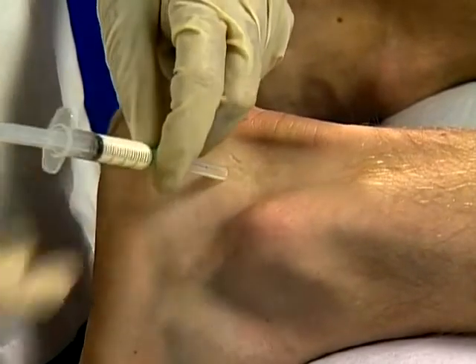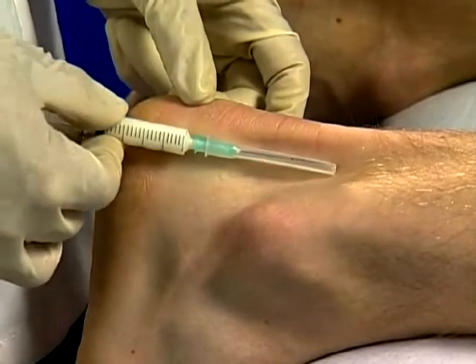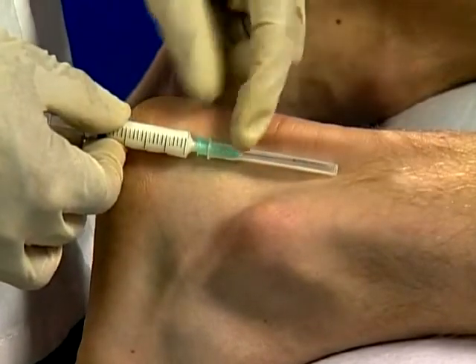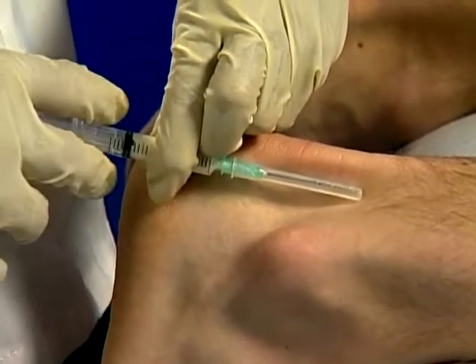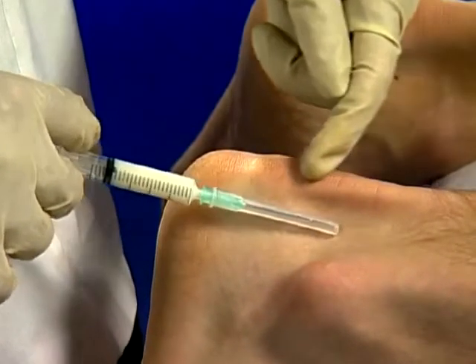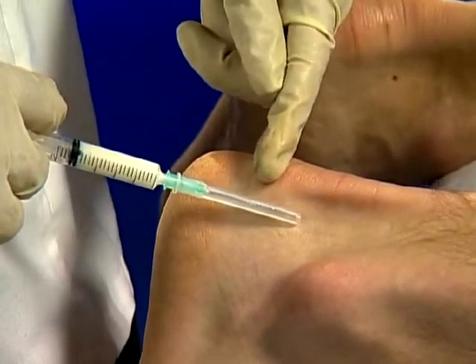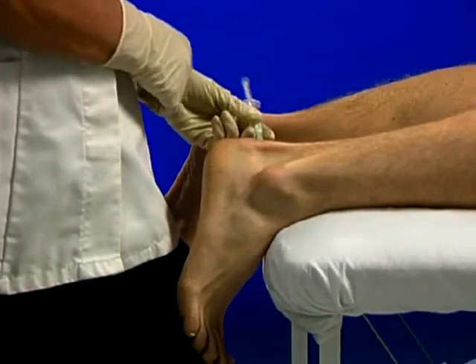Without entering the tendon, angle needle proximally so that it slides under the skin to its full length. Aspirate and inject half the solution as a bolus while withdrawing the needle. Repeat the procedure on the other side.